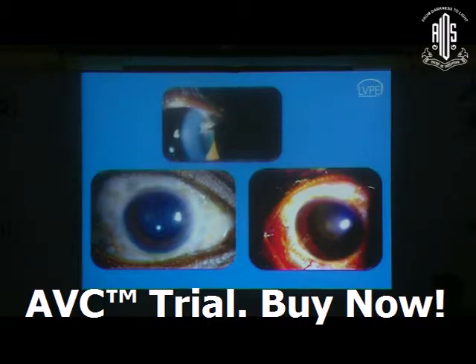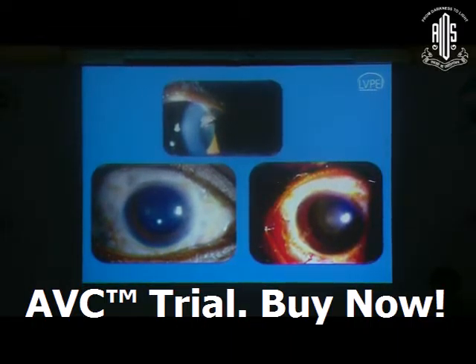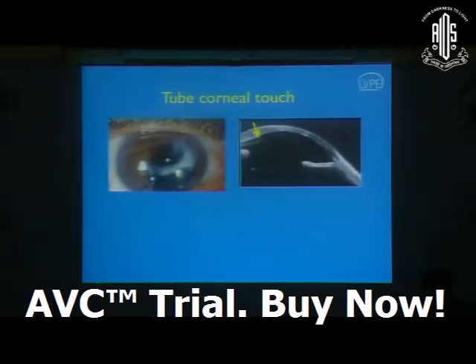That means that much of oil has gone into the tube and what you're seeing just a little outside is just a little bit there. So most often in patients like this, we tend to do an inferior implant, although we may argue saying wherever you put the tube, if the patient is lying down, the oil is going to go there, or if that is the only way out of the eye, whether it is superior or inferior, oil can still reach there. But most often we tend to do it inferiorly because you want to avoid. But if you see oil in the anterior chamber during the surgery, try and wash it as much as possible.